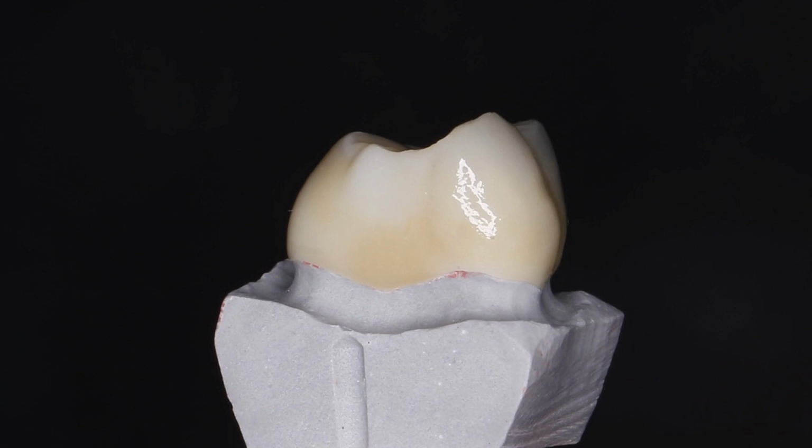But when the margin of the crown is subgingival, especially with the vertical crown, when there is no related point like a shoulder that you can check, it's more difficult to judge whether the crown is in the perfect position, like on the abutment on the gypsum model. So in this episode I would like to give you some advice on how you can eliminate the risk that you cement the crown in the wrong position. So please check this case.